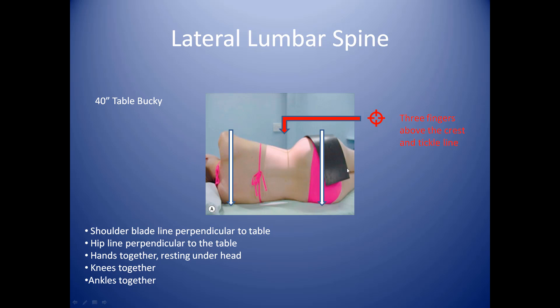You can touch the patient at the waistline — if the patient is a bit heavier, you can feel the flaps on either side of the spine. If those flaps feel lined up to the table, use that as a measuring tool. Touch their hip and their waistline to determine, by eyeballing and feeling, that the patient is as lateral as possible. Then, just like the front shot, center three fingers above the crest. I call this the tickle line.